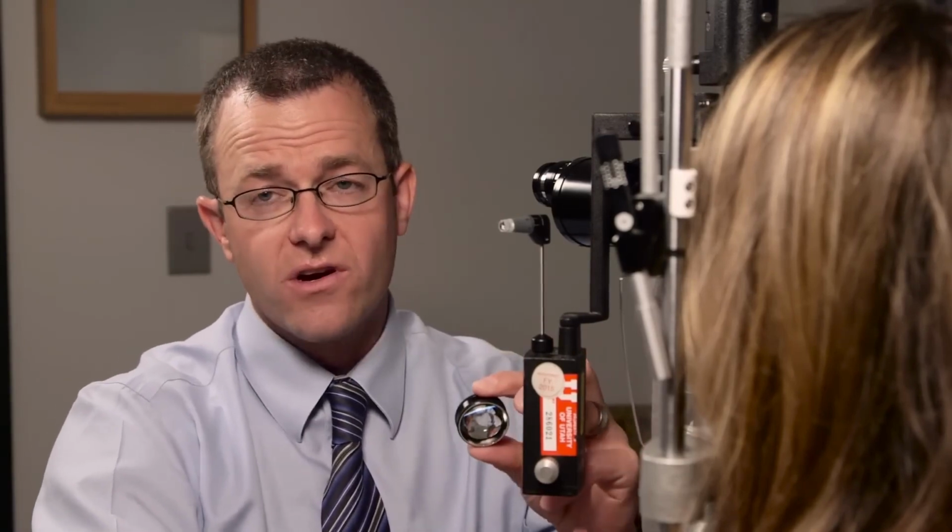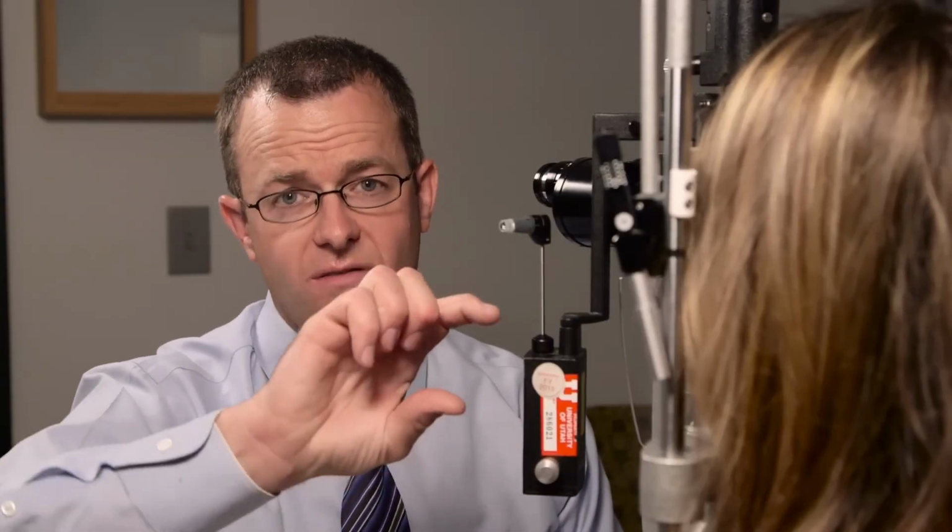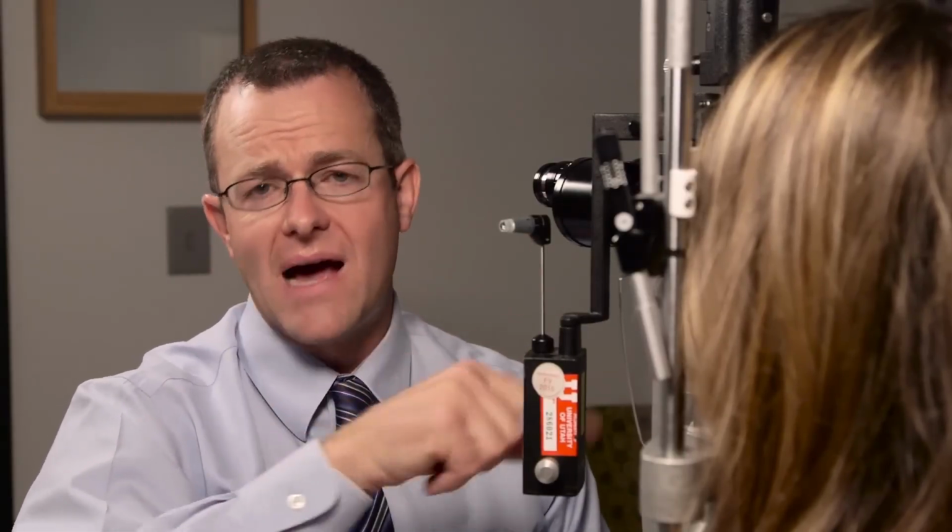So after you see the nerve, you're going to pull nasal and swing the slit lamp over towards the macula to get a good view. After looking at the macula, then generally I will swing and look at the blood vessels. I'll travel along the superior temporal arcade and the inferior temporal arcade and get a good look at the blood vessels. And then I'll look a little bit past that. In general, with the 78 diopter lens and the 90 diopter lens, you can see into the mid-periphery, past the macula a little bit. From there, you're going to take over with your indirect ophthalmic exam.